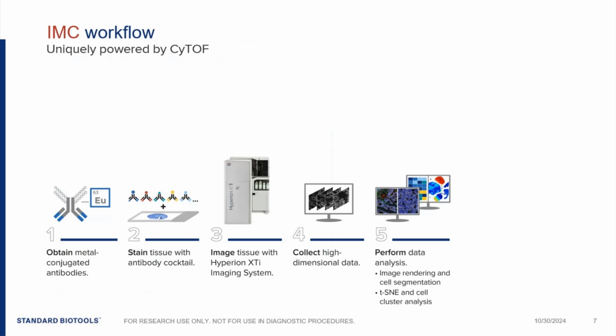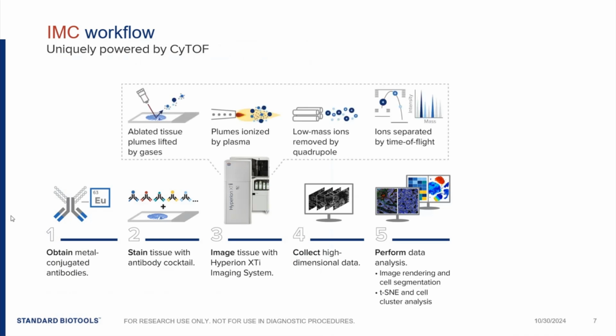Later in the presentation, like I mentioned, I'll discuss some of the advantages to using Visiopharm's Phenoplex software for analyzing Hyperion XTi data. But how does this underlying technology work altogether? As I mentioned before, this instrument utilizes imaging mass cytometry. Essentially, we're generating tissue images without the use of light.